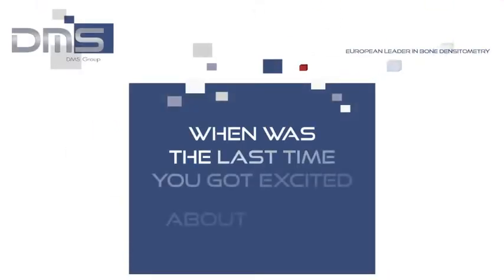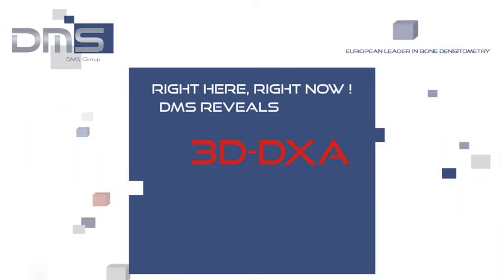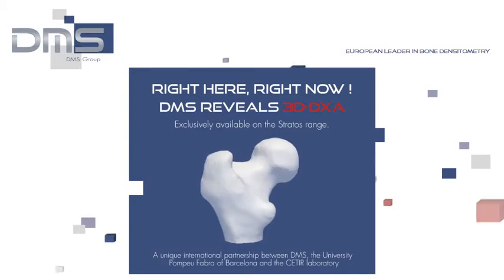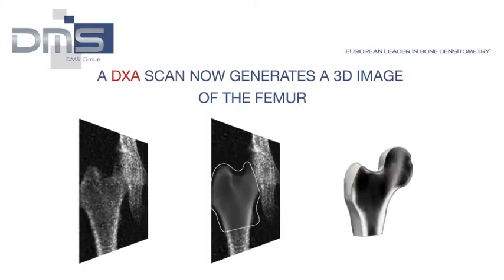When was the last time you got excited about DXA? Right here, right now, DMS reveals 3D-DXA. A DXA scan now generates a 3D image of the femur.